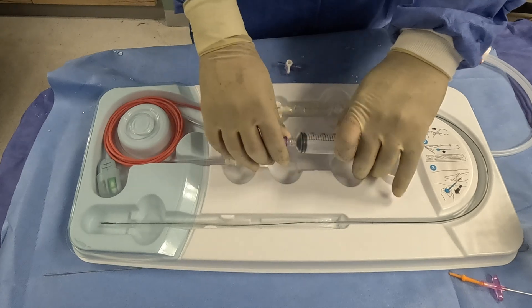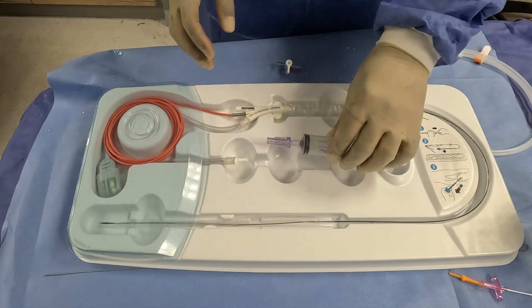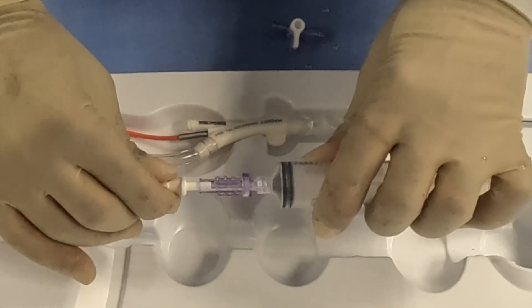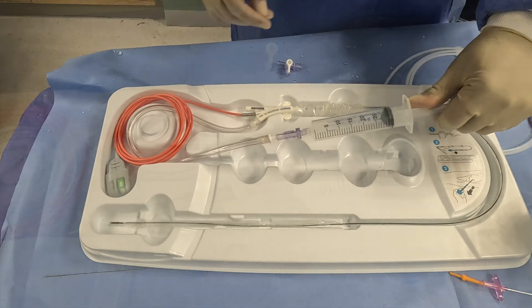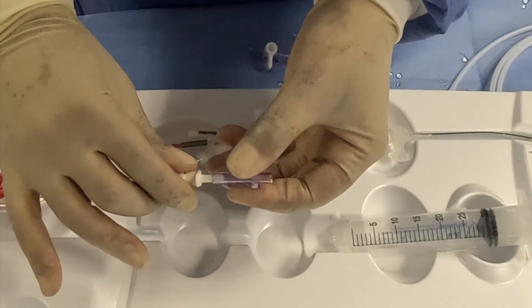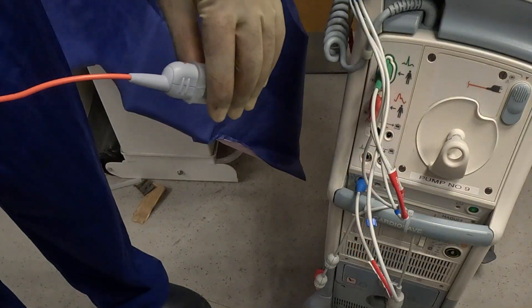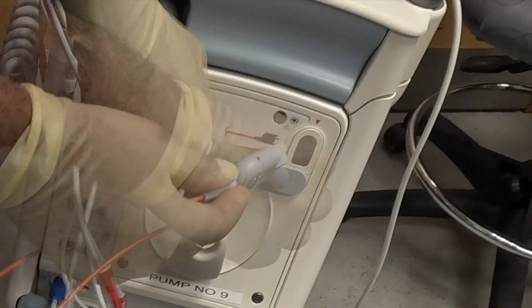In the meantime, get the intra-aortic balloon catheter ready for insertion. Firmly attach the one-way valve to the lower fitting of the intra-aortic balloon catheter, connect an empty syringe to the other end, and apply around 30cc of vacuum. Remove the syringe while keeping the one-way valve attached. Pass the fiber optic cable to the perfusionist to connect to the console and calibrate before the catheter is inserted, to ensure a waveform is obtained to identify whether it is in the artery and not the vein.